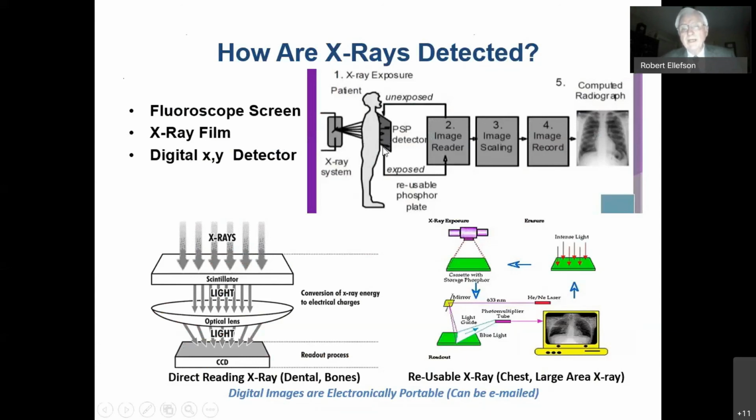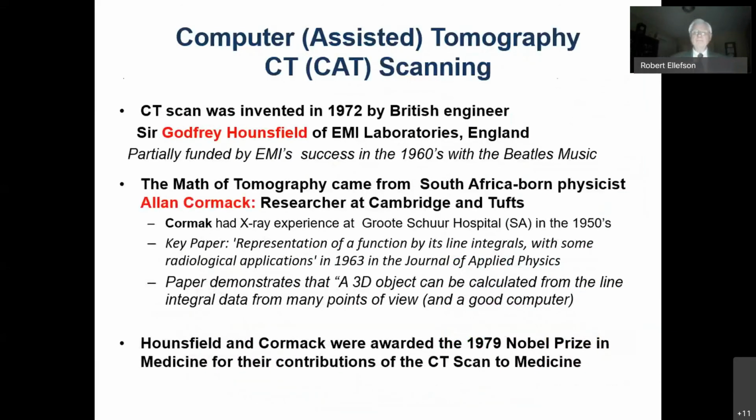You do the X-ray, and then you remove that X-ray plate, put it through a reader so that you can digitize the excitation that's occurred on the phosphor screen, and then record that, use it as the record of the X-ray, take intense light and re-establish a baseline for the phosphor for it to be used again. So this makes a reusable type device that yields the X-ray information that you need and want.